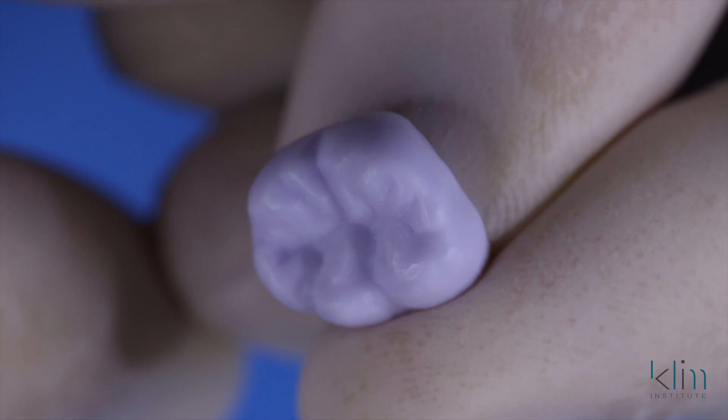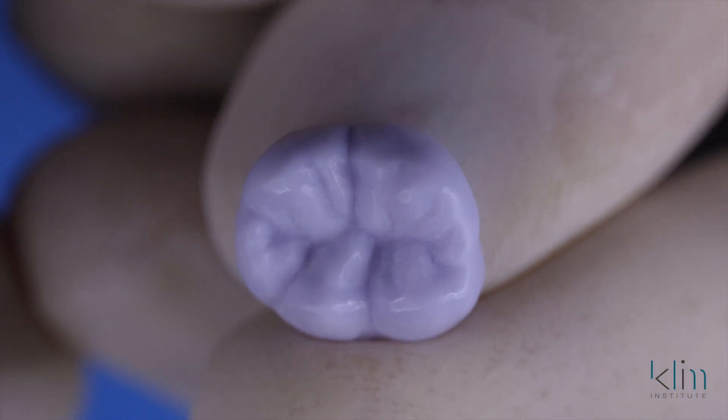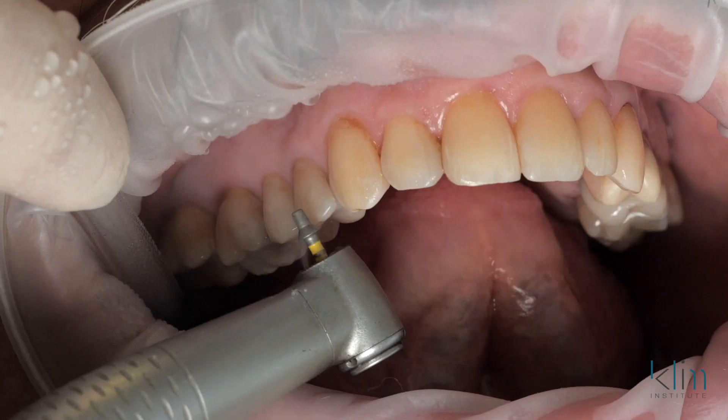The other thing you'll notice in this series of videos is the occlusal morphology. I'm a really big occlusal morphology person. It goes way back to my years with gold, particularly in dental school, where we learned morphology. Morphology is about function — it needs to fit the mouth you're working in. In the CEREC software, your morphology will be great as long as you have enough occlusal reduction.